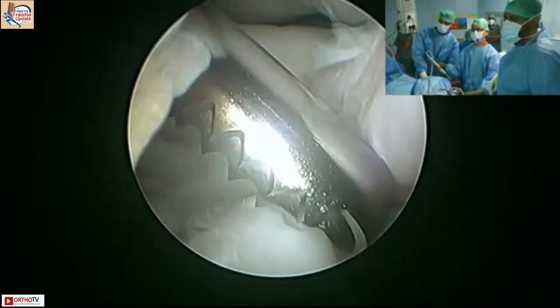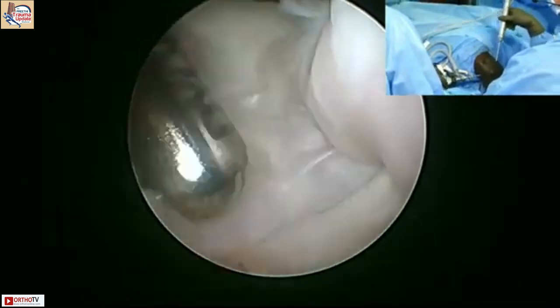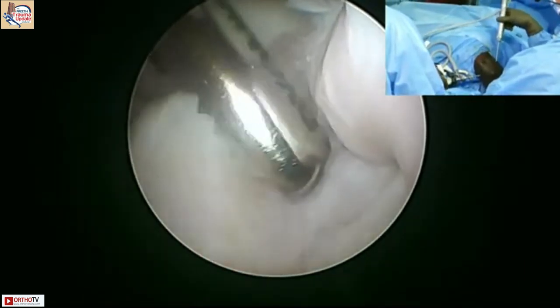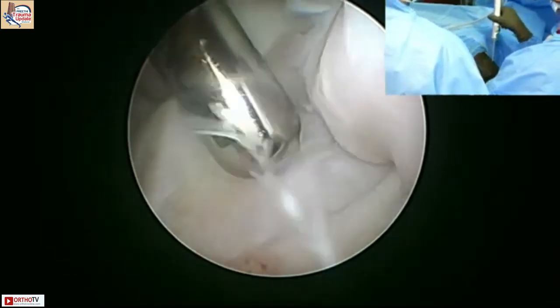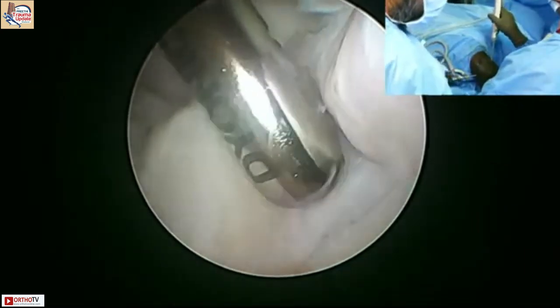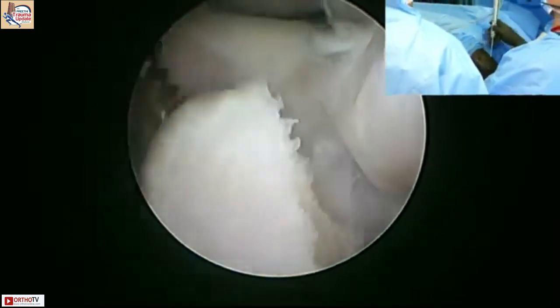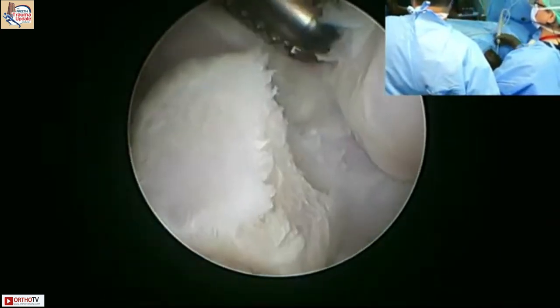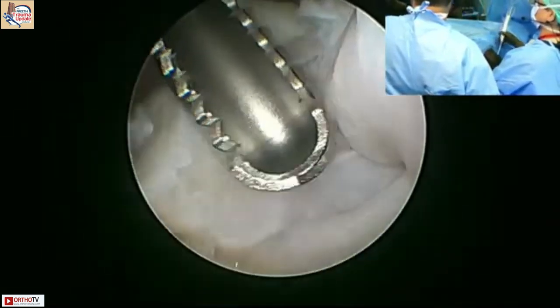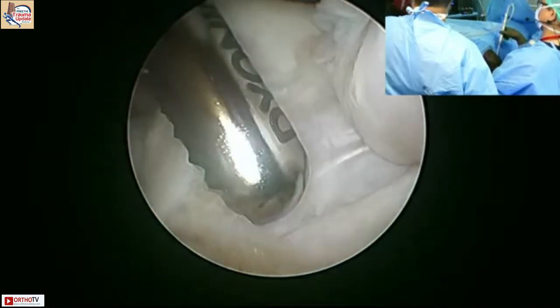So I'm not used to hand control, so bear with me. I'm used to foot control. You are doing good, great job. Thanks, Abhijit and Gautam. So the problem is, I am so used to working with the foot, so I can concentrate on movement of the shaver. That is something that I would advise people.